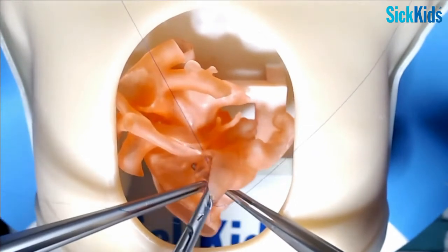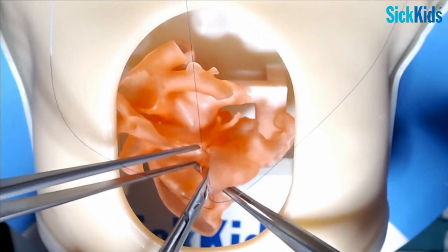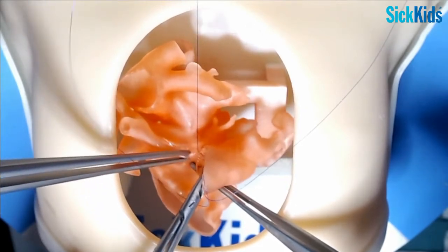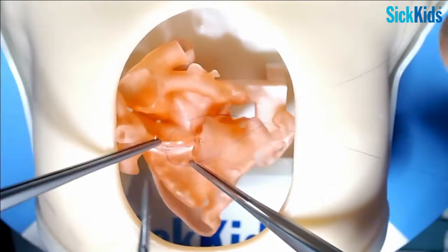Now some people will do interrupteds and not make this counterincision. That's fine as well. A lot of people have moved to this side by side because you seem to get a really nice, generous anastomosis for the DKS. At the end of the operation, we always look and make sure there's good flow there.